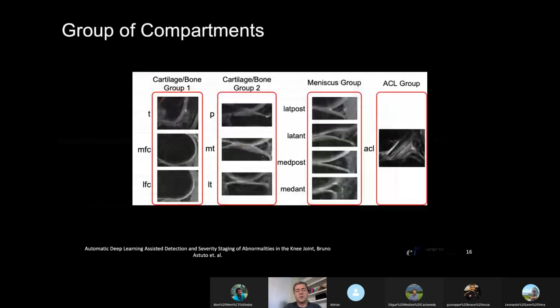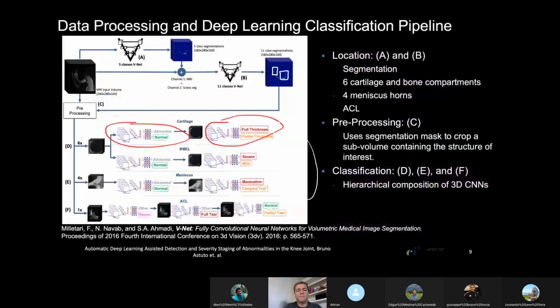But to answer your question, we tried first here in this step. I do it hierarchically, right? So I do normal, abnormal, and then the assessment of the abnormality. I tried a 3-class setup: normal, mild lesion, and severe lesion. The results were not so good. Separating the problem like this gave us a better result. That's why we went with this approach. So this is one reason why I use more models.